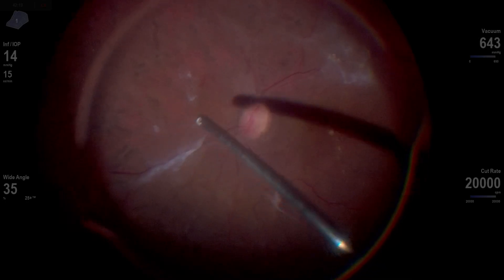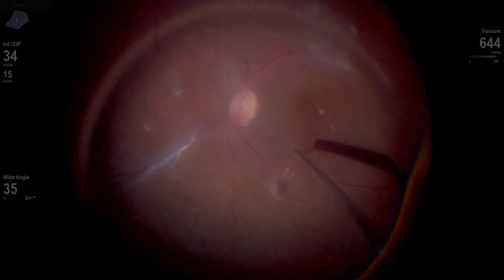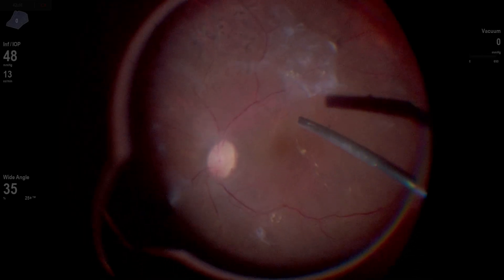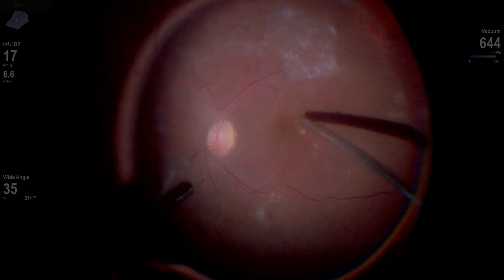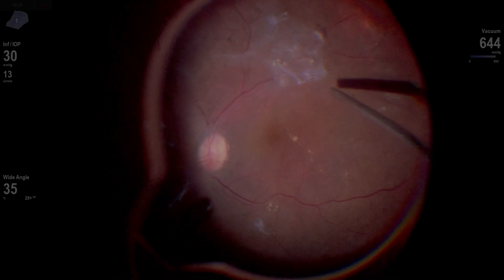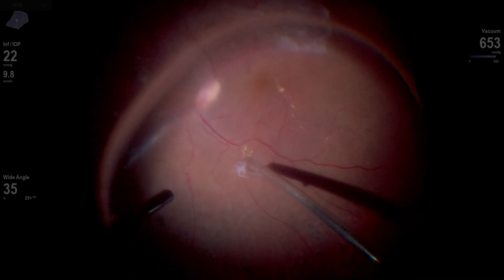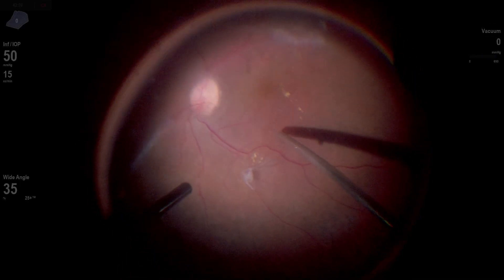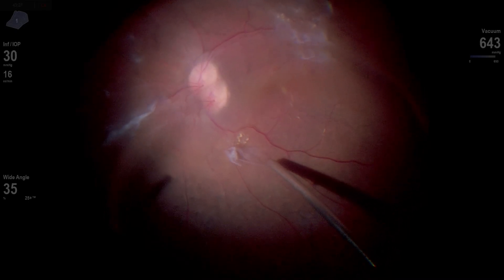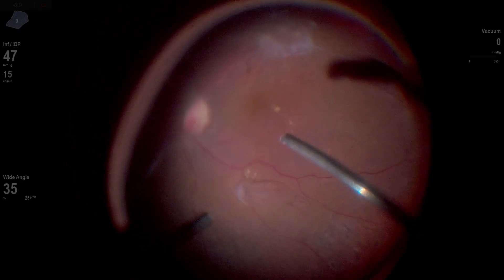This line of fibrosis along the superior nasal arcade I'm going to end up leaving, because it really wasn't exerting any significant traction. Here I'm actually able, just by aspirating and seeing the vitreous and retinal tissue react, to find an edge over the macula. I'm able to elevate that and now work on the temporal edge of that little fibrotic plaque along the superior temporal arcade. I'm feeling like I'm having some positive movement here.